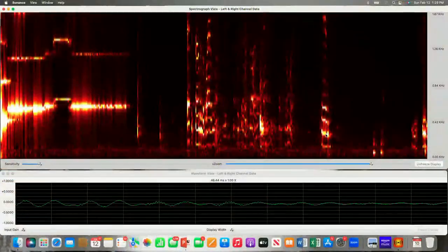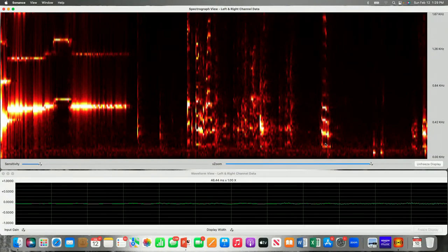And the heart is the same way. The heart produces a lot of harmonics, in fact, so many harmonics, and there are so many fundamentals in a broadband sound that you see energy almost continuously across frequency with time. Now, even though my ch didn't come through too well, that's where you hear heart disease. In the diastolic interval after the dub, blood flow increases in the coronary arteries up to the point at about the 25% mark in the diastolic interval where the flow is a maximum and the turbulent noise would be a maximum.